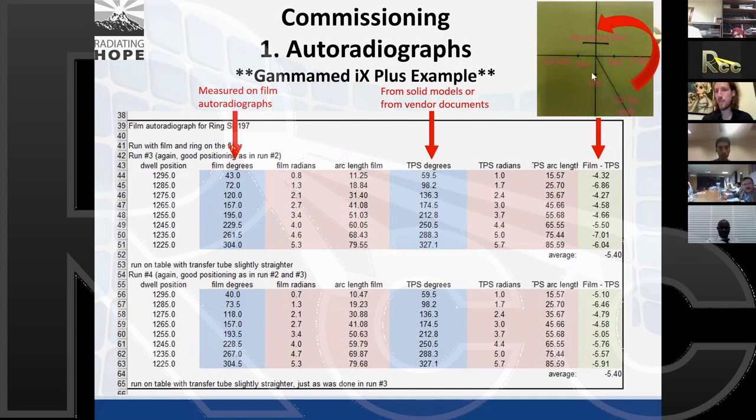And noting in my example here, the vendor documents specified 0 degrees horizontal, going counterclockwise for the direction. So that's how I specified my angles as well. Again, this will depend on your vendor. You can recreate the concepts without following exactly what I did, with your particular treatment planning system, your documents, your applicators.